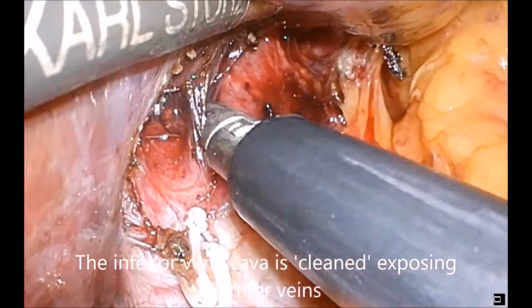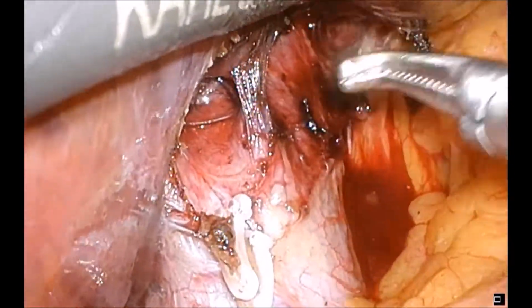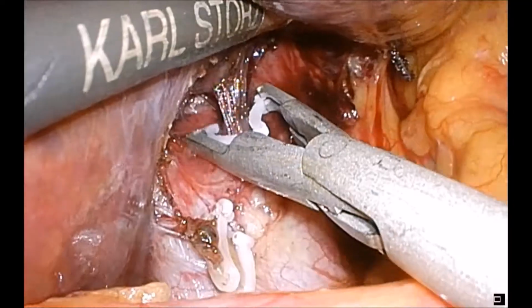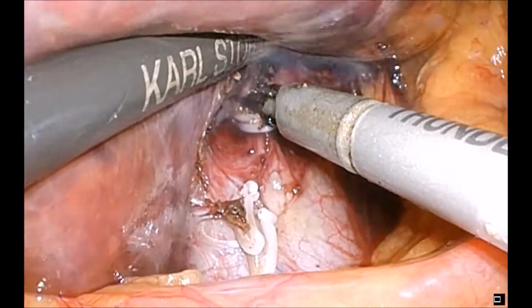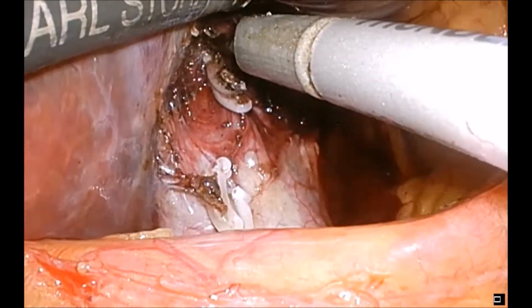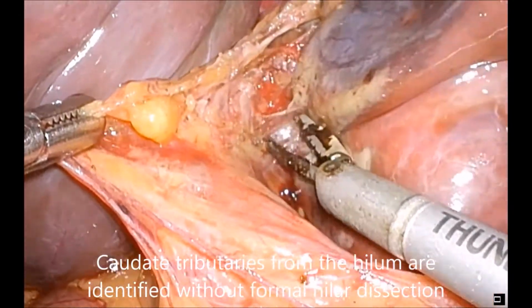You can see that the laparoscope allows the vision all the way along the length of the inferior vena cava here to be able to identify these small vessels, which are readily clipped after dissection. The caudate side is controlled with bipolar diathermy before cutting through to minimise the number of clips and avoid clip traffic.